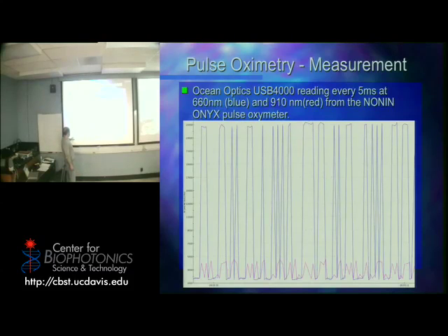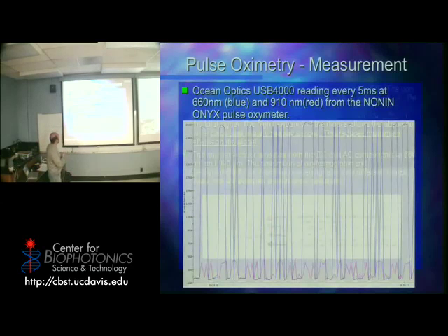Which is either one light's on, then the other one's on. And I know you see some overlap. I don't have enough spatial resolution to separate it. But you see them both on and then a period where it's off. So this was trying to confirm, and this is how this thing works. So it's measuring a lot of light, turning off, the other light, turning off, a lot of light, turning off. It's doing that same thing. Okay? Just as predicted.